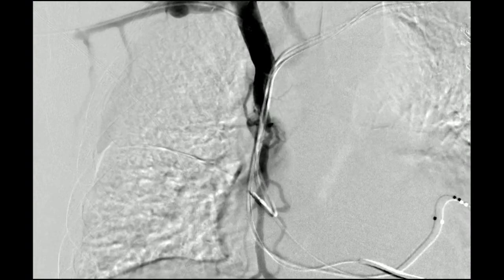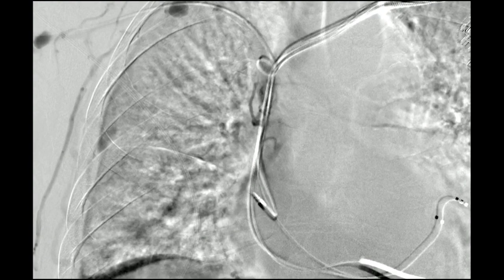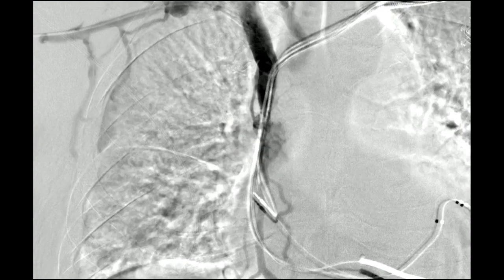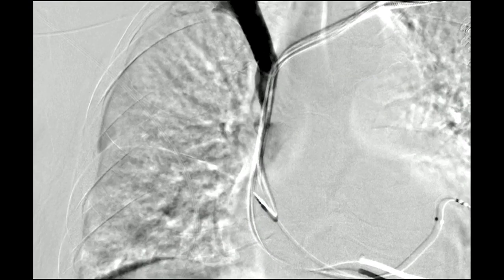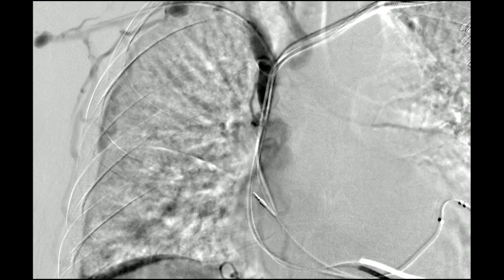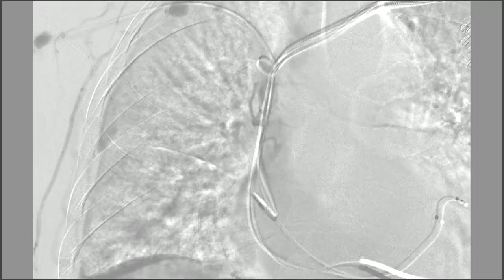Now you can see collaterals coming down through a short segment stenosis, and we're actually opacifying the distal superior vena cava. So we have two pieces of information: number one, can you cross it? Number two, what are the proximal and distal areas for potentially landing a stent? This was done as a diagnostic study and we'll come back another day, because it's a lot of work to remove the defibrillator and potentially not even be able to cross the stenosis. That's an example of how we would evaluate a process like this.